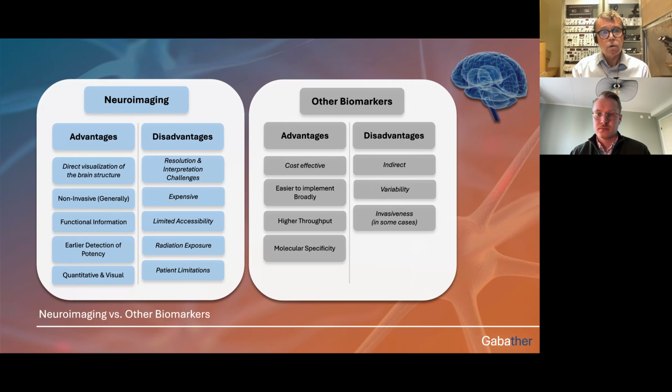Having said that, with neuroimaging, the data that you get are very complex. Now you're not looking at a protein concentration in the blood, but you're actually looking at functional connectivity between different brain areas with different frequencies and so on. The complexity becomes very, very much bigger, and then the interpretation becomes, of course, trickier. But it's the quality of the information, I think. And since we didn't have a 200, 300 patient study, but only 17, the ones that we are going to present, I think that was the way forward.